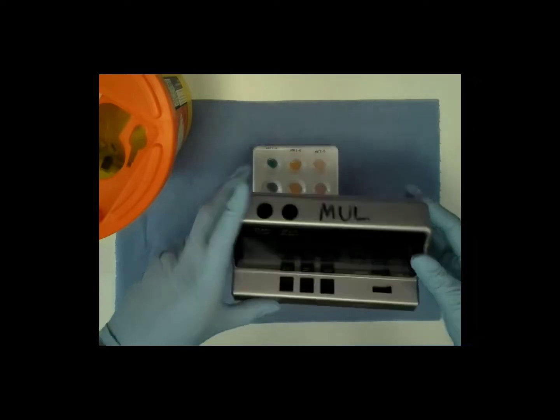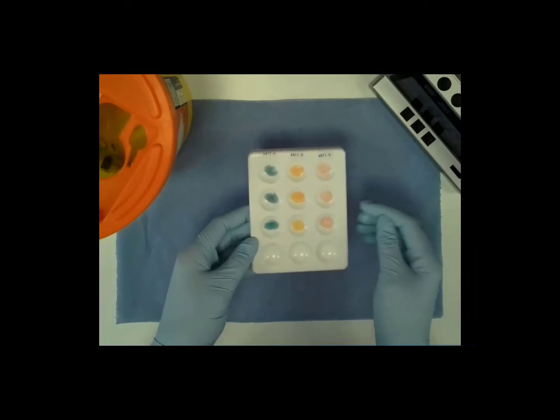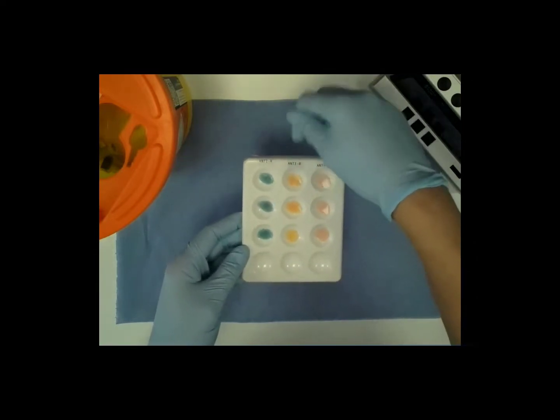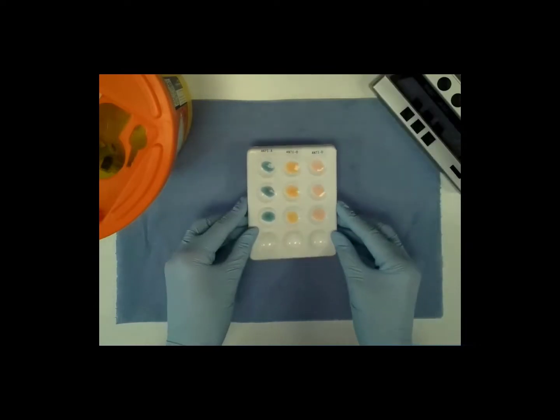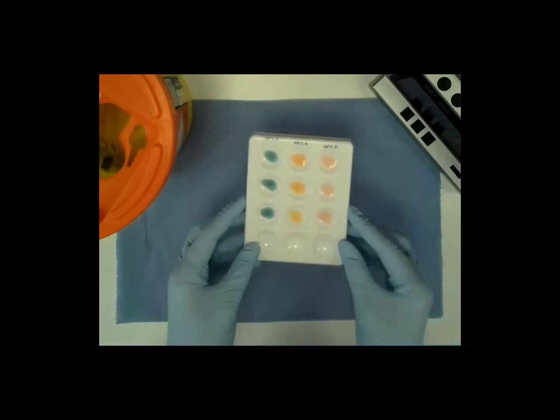Stop the timer and carefully lift the plate and tap it gently on the sides. This will encourage the antibody and blood aggregates to form. These should be visible as small grains of sand at the base of the well.